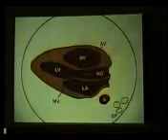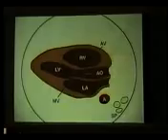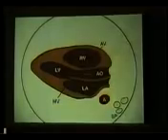So here is the schematic diagram of a long axis of the aorta, which arises from the left ventricle. The left ventricle will show that the blood goes into the aorta, and you will see some bright echo between the aorta and the left ventricle, and that is the aortic valve. Seeing the aortic valve is very important, because some patients might be born without the valve in the pulmonary artery or the aorta, and for that bright dot you have to increase the master gain in order to see that aortic valve as well. So here is the picture.